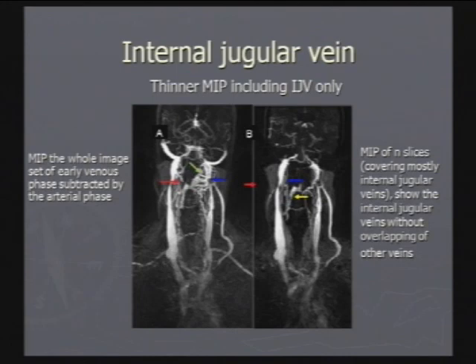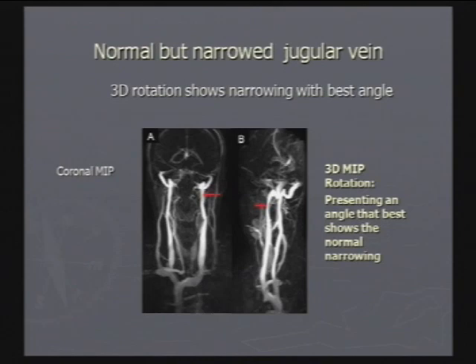And this is where we really need comparisons with the angioplasty. This is a normal person. Can a normal person have narrowing up in that part? Sure. I mean, that's a pretty difficult area for the vessels to traverse. And if you look at this, you can say, yes, that looks narrowed. But you can see the rest of the veins look just fine in that case.